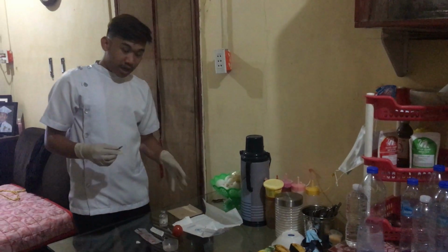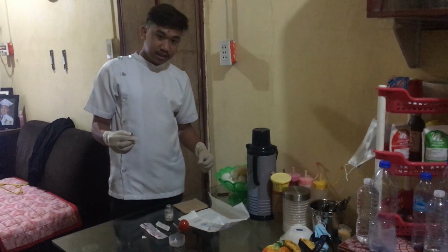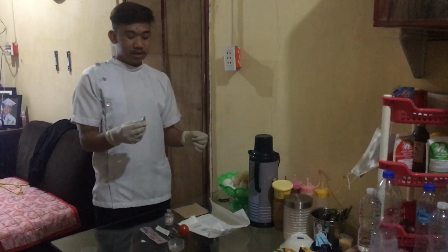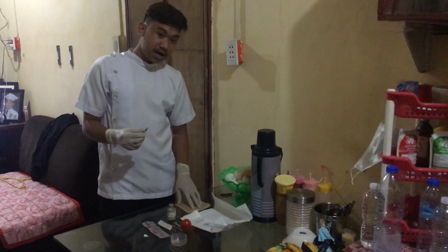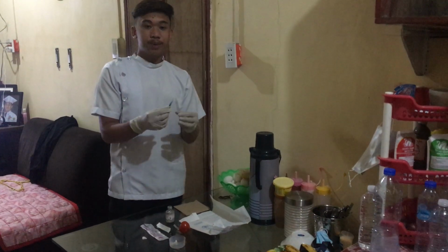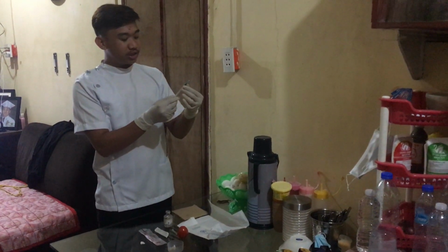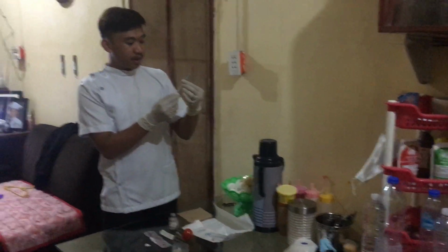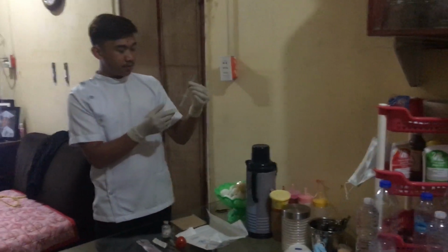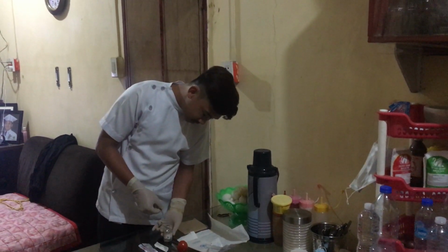you're going to look at the MAR for how many cc the medicine is prescribed by the doctor. In my case, the prescribed amount of medicine is 0.5 cc. So I'm going to inject 0.5 cc of air, and then I'm going to inject it into the vial.